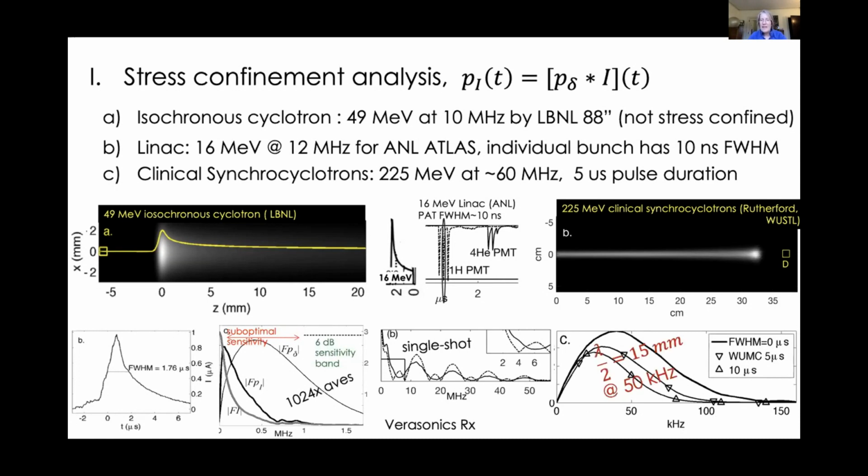So, one other point I want to make though, is now, because my frequencies are so low, we're down around 50 kilohertz, say, lambda over 2 diffraction limit is 15 millimeters, which of course is not acceptable. We need to be much, much more accurate. So we need to think about this not in terms of an imaging problem, if I want to localize where the treatment spot is, but rather think about it a little bit differently.